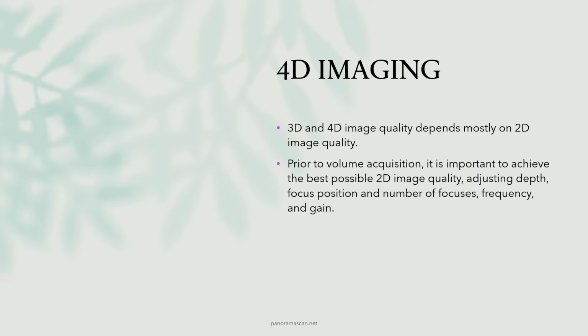The focus position is equally important. Setting the focus at the correct depth guarantees that the structures you're interested in will appear sharp and well-defined. In some cases, it may be necessary to use multiple focuses to capture fine details at different depths. Frequency plays a significant role in optimizing image quality. Higher frequencies offer better resolution but shallower penetration, while lower frequencies provide better depth but with reduced resolution. Finding the right balance between these is crucial for visualizing deeper structures while maintaining clarity.